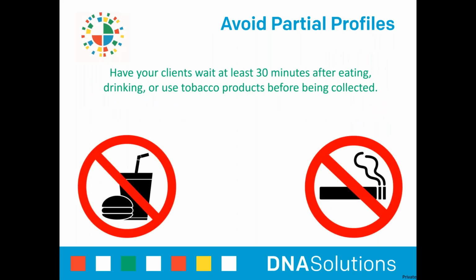Before performing a collection, it is important to speak with your clients and ensure they have not had anything to eat, drink, or smoke before moving forward. Other things to inquire about as well include chewing gum and other tobacco and marijuana products. A small amount of water prior to a collection should be fine. However, please have your client refrain from drinking prior to the collection, as this could dilute the number of buccal cells you are trying to collect.